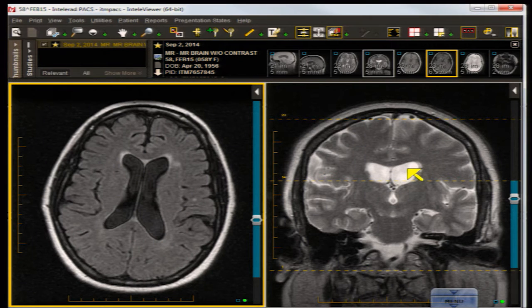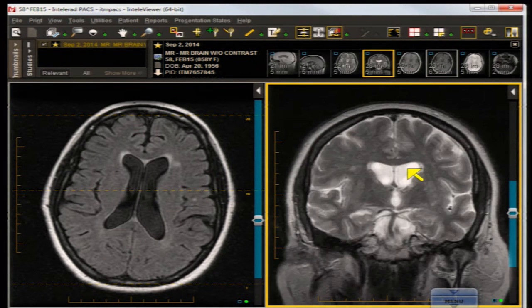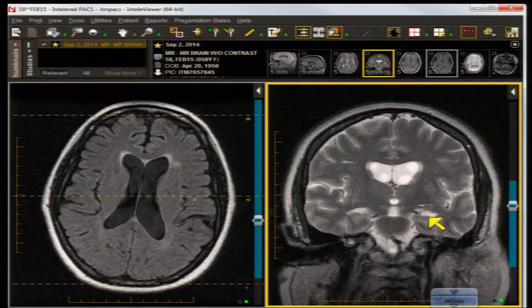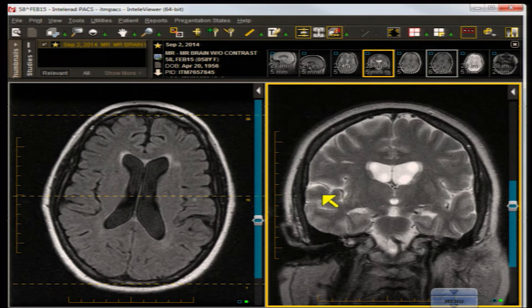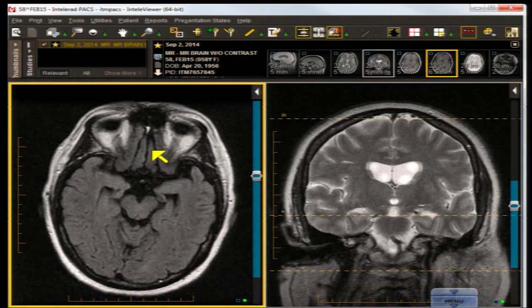On the coronal T2 water-weighted image, you might have noticed that the left temporal horn is a little larger than the right temporal horn, and for age 58 there is generalized atrophy. Let's go back over to the axial FLAIR image and look at the prominence of the sulci of the olfactory gyri and orbitofrontal gyri.